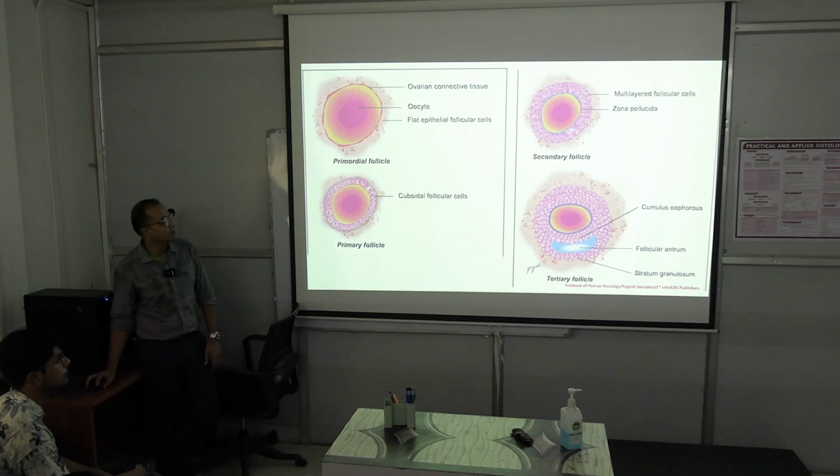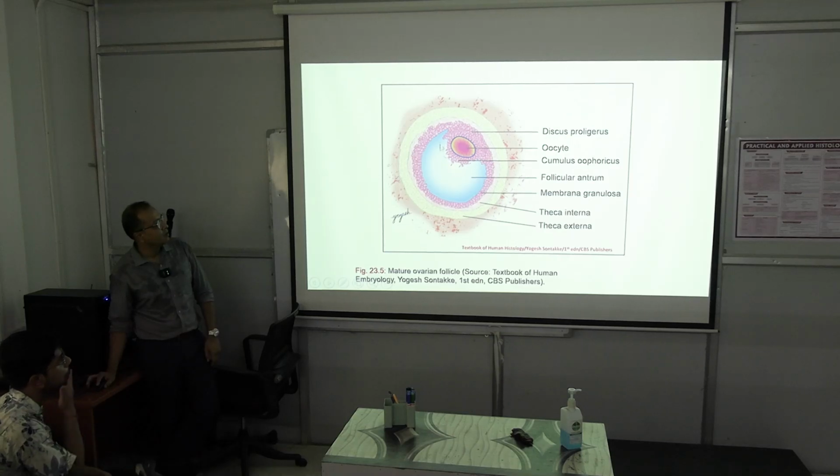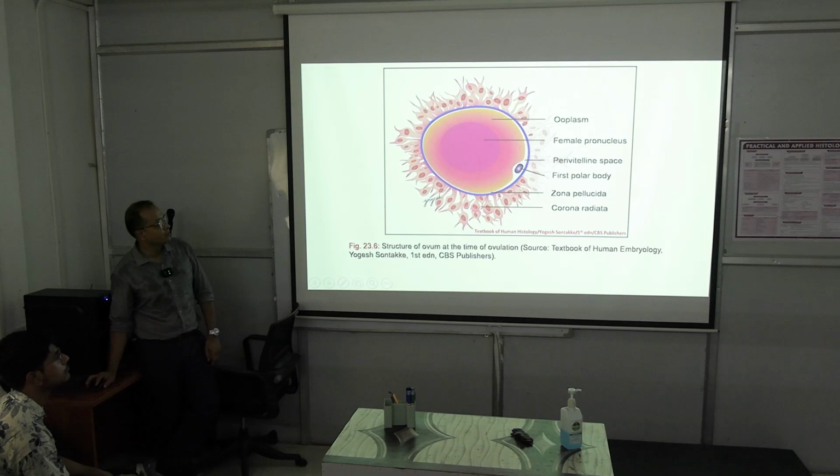And then we have the Graafian follicle, which looks like a large follicle, with the secondary oocyte where cell division is taking place. These are the corona radiata surrounding it, and some of the cells anchoring to this part we call the cumulus oophorus. Then this element is ready to be thrown out, it ruptures, and the secondary oocyte is liberated with these cells, surrounded by the zona pellucida coat and the corona radiata.